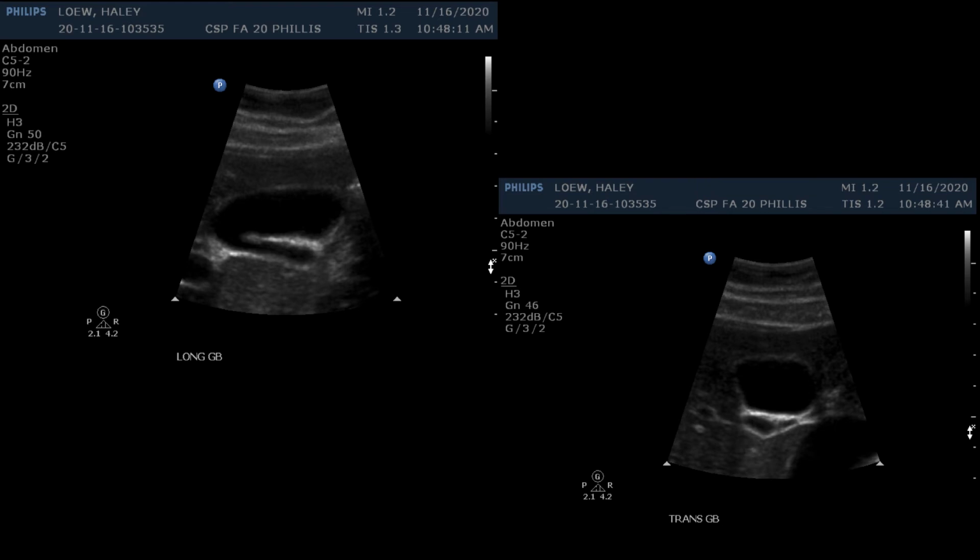fundus. You should sector in on the gallbladder to reduce the number of scan lines. You should also turn down your gain to clear out the gallbladder, as well as use TGCs. Make sure you are imaging in harmonics.